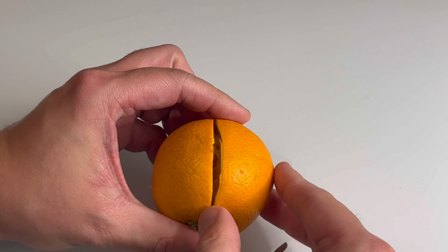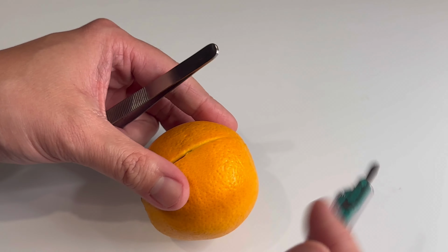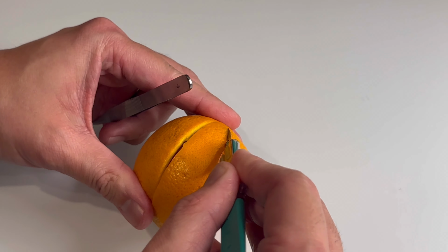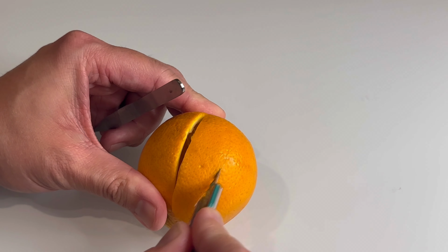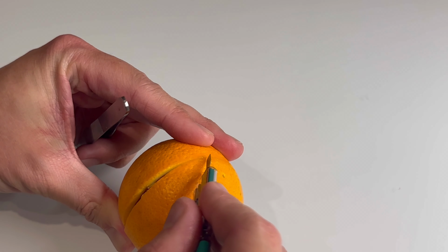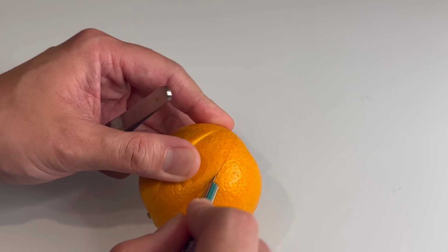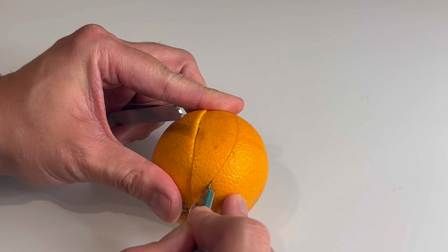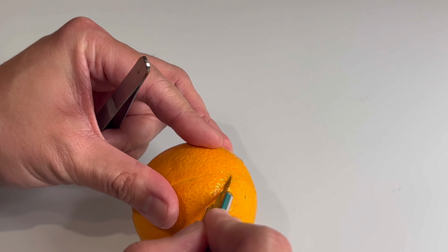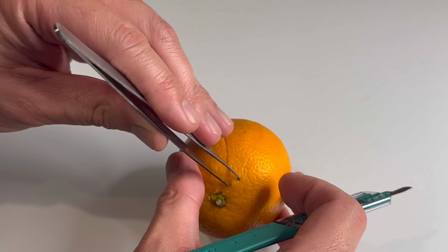And so from there, let's actually explore. And we're going to cut a piece of skin. We're going to excise this piece of skin and take it out. The other important thing is actually how you use a knife. You never really want to put blunt force on a knife. You want to use it as a sharp blade. You could see we're putting the knife and then just exerting enough pressure.